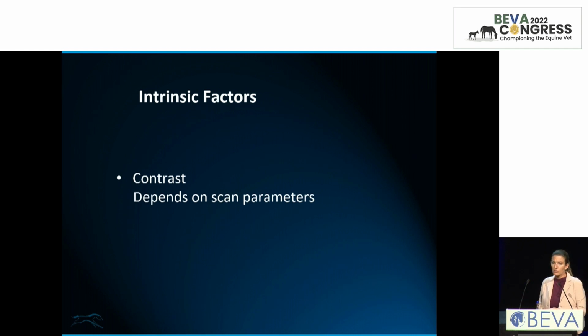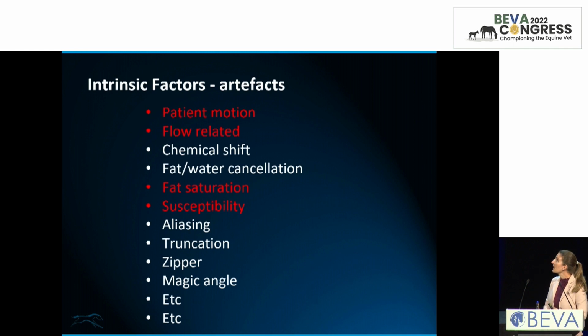I don't want to talk too much about contrast. It depends very much on scan parameters. And moving on to the artifacts, there are loads of artifacts, and I will talk about a couple of the practical ones, because if we start going into all the others, we might be here and lunch will be over.